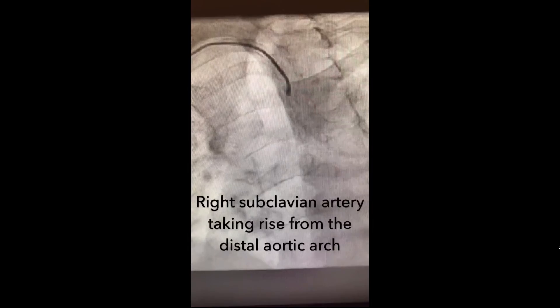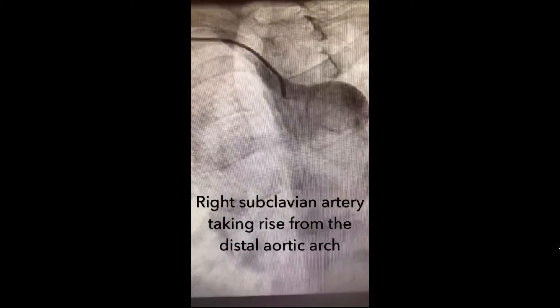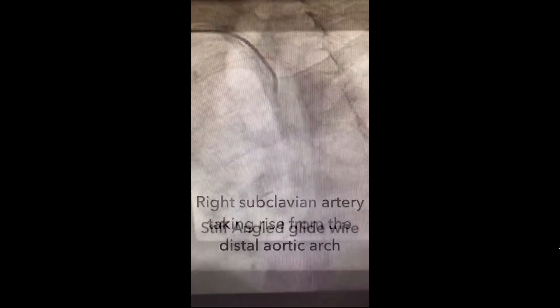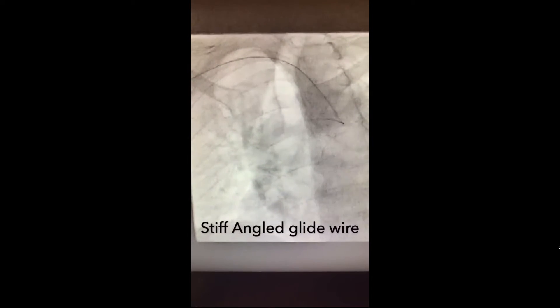As you see in this case, the wire behavior suggested that. You can see that the right subclavian artery is the last branch of the aortic arch, which is obviously aberrant.